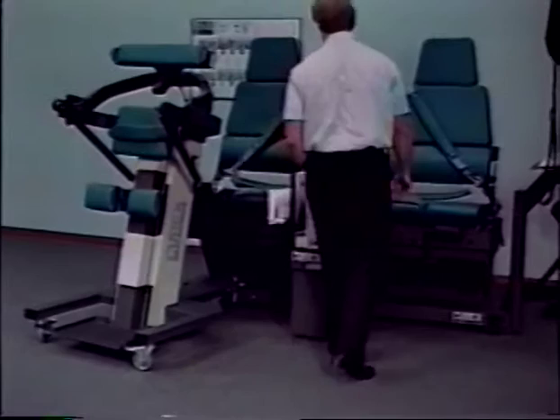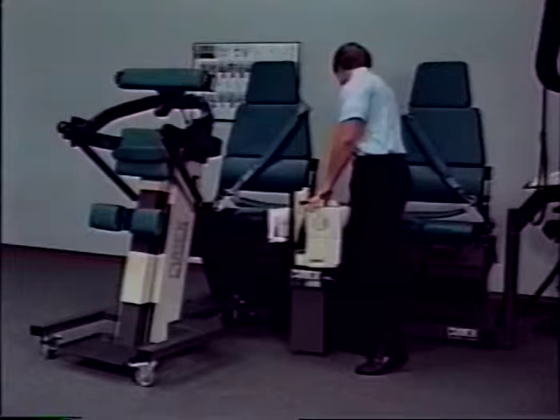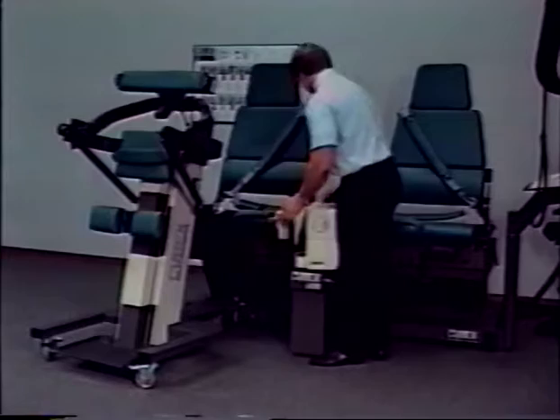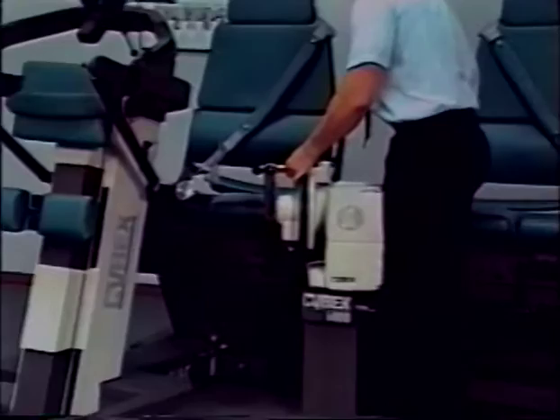Set the dynamometer speed to 30 degrees per second and then move the O range of motion stop to 34 and secure. Position the dynamometer input tube vertically so that the end of the locking knob and pull button is pointing up. Hold the dynamometer input tube in that position.